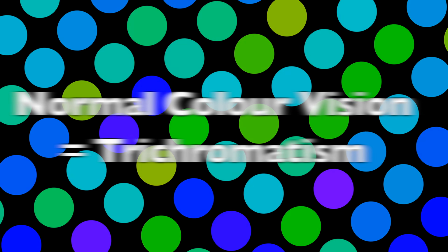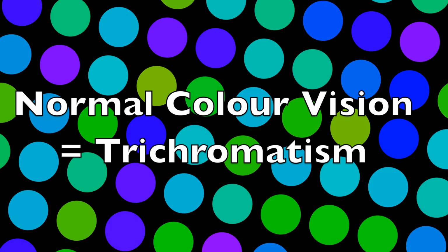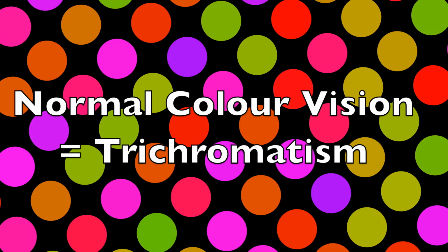So with that in mind, before we go on to look at how to use the Ishihara charts, I thought it might be a good idea to look at what colour blindness actually is. So normal colour vision is termed trichromatism, i.e. you're able to see the red, green and blue in their true forms. Away from trichromatism, the majority of colour vision deficiencies are actually red-green colourblind. There is a yellow-blue deficiency, but that is very rare and certainly not something we need to discuss today.